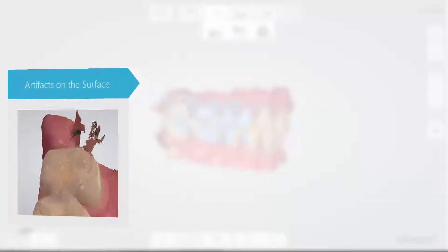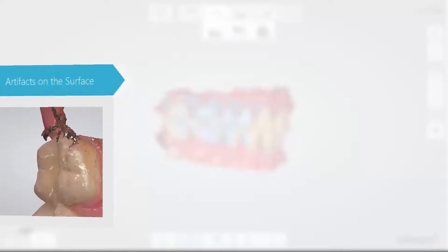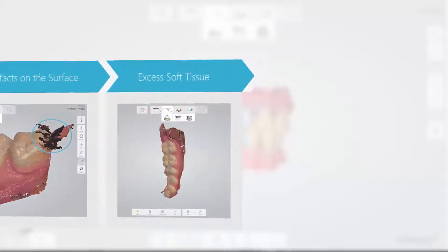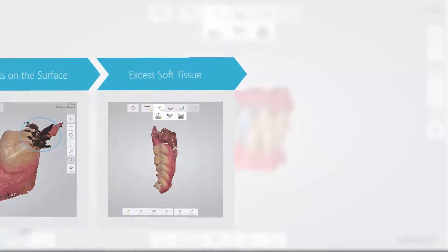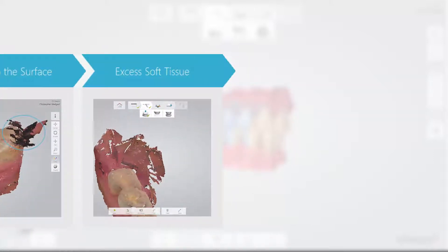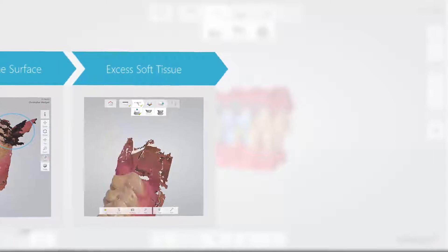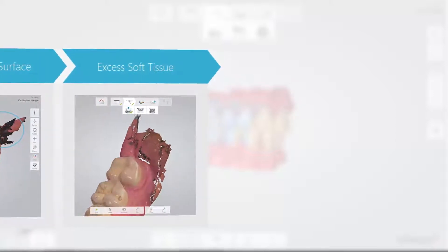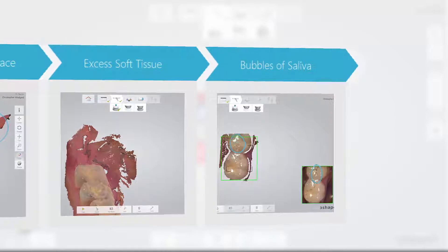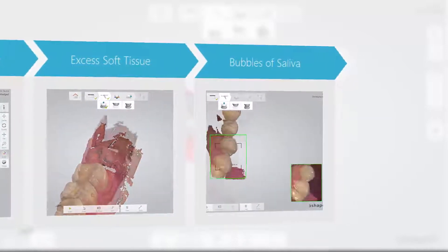Fix this by retracting soft tissue from the teeth while scanning, using for example a dental mirror. Second, avoid excess soft tissue at the back — distal of the last molars or large portions of sulcus to the cheek. Third, avoid bubbles of saliva being scanned onto the occlusal surface — dry the teeth before scanning.